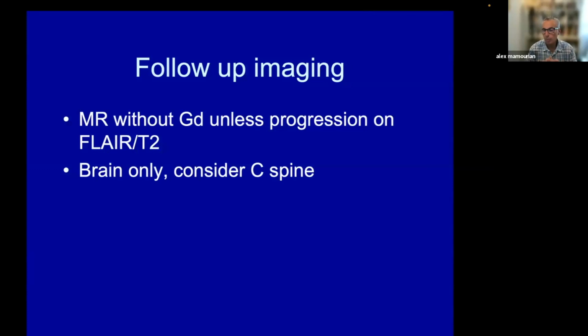Now, in terms of follow-up imaging, once the diagnosis is established, and of course, for a long time, the diagnosis of MS was felt to be a clinical diagnosis, although frequently it is now a diagnosis that incorporates the MRI findings. But follow-up imaging is considered part and parcel of the management of patients with demyelinating disease with the utilization of immunomodulating medications. And so the decision about the type of medication and dose of medication is based on the appearance of progression on imaging.